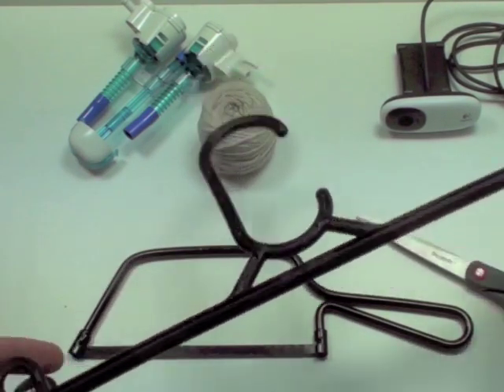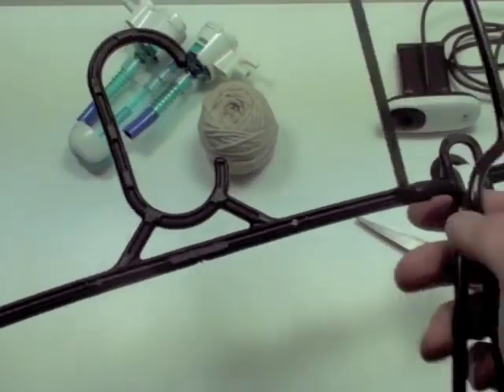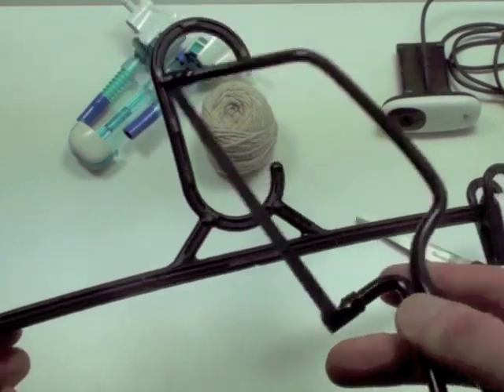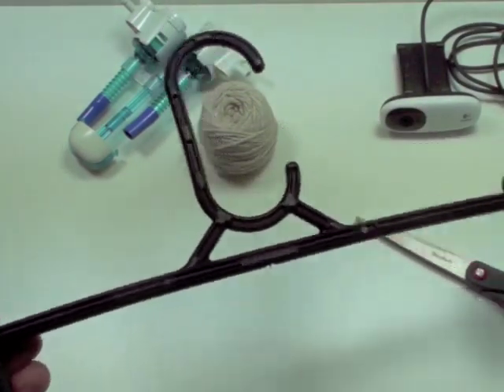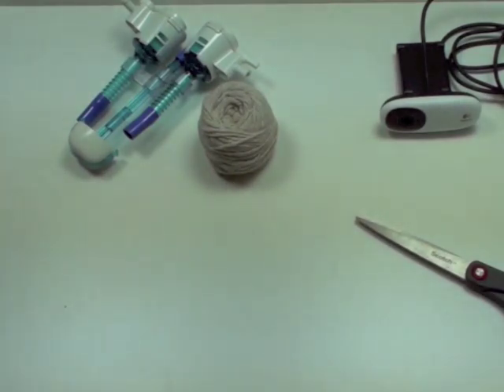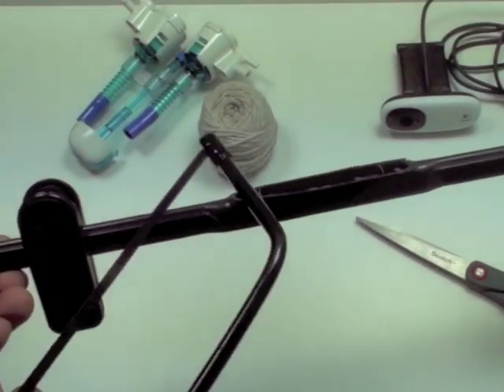Now the first thing you're going to be doing is removing the hook from the skirt hanger. We do that just by using the hacksaw across there. And that will leave you with something looking a little bit like this, without the hook.